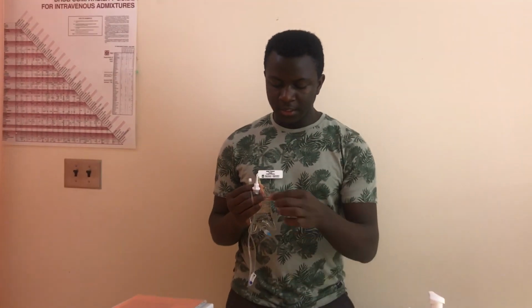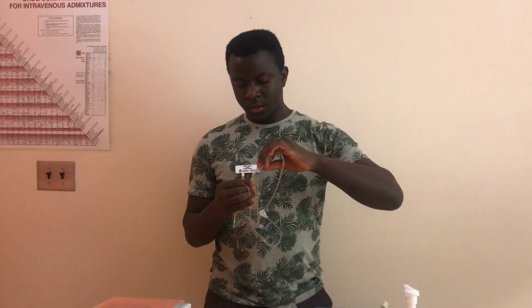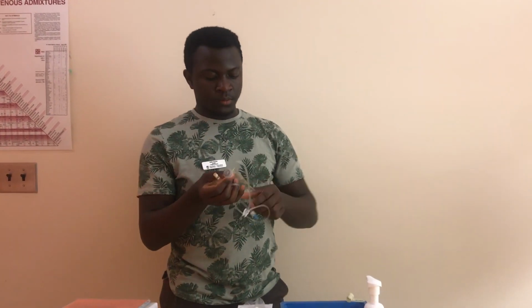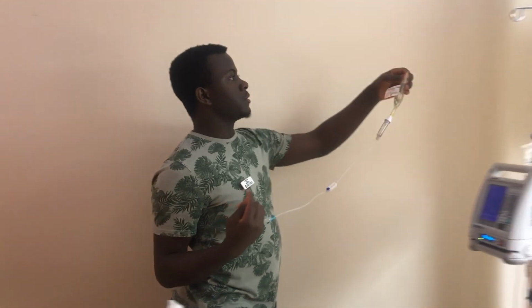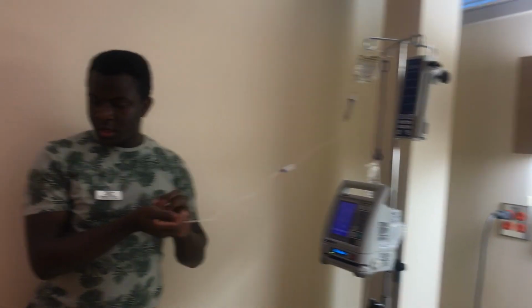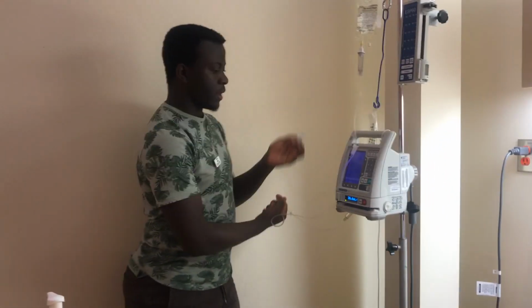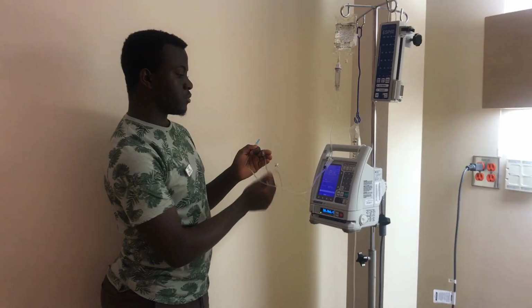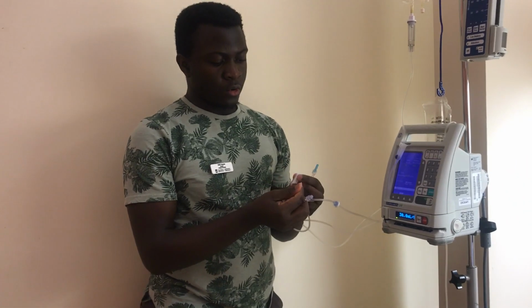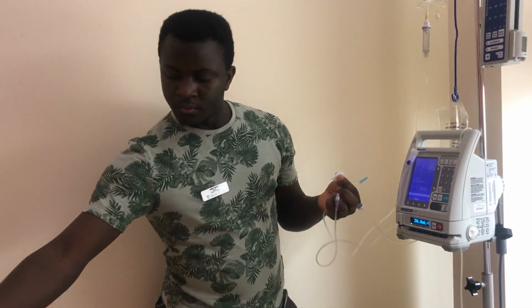Here I put my spikes there. And now I'm going to draw back. I'm going to put my medication. I'm going to throw this into the sharps container. And using an alcohol swab, I'm just going to clean the port right before the pump, because this medication is going to be regulated with the pump. So clean my port.